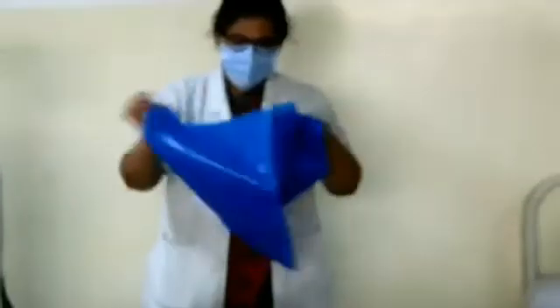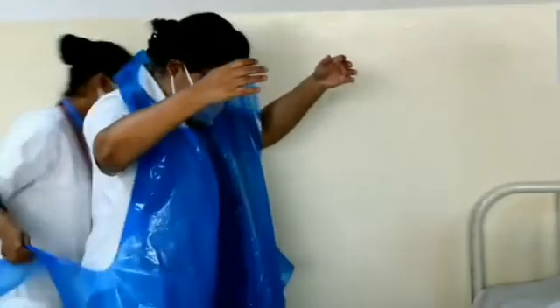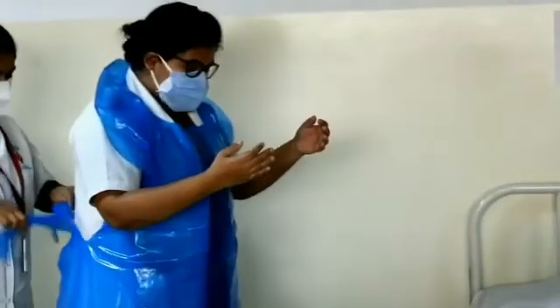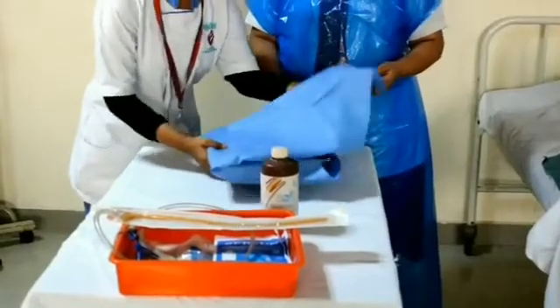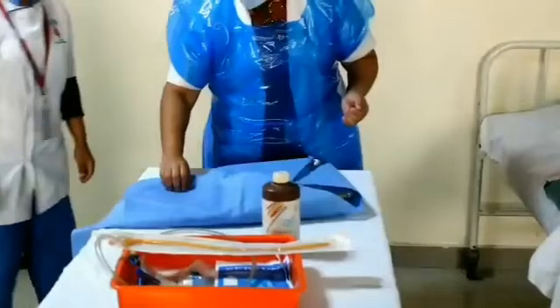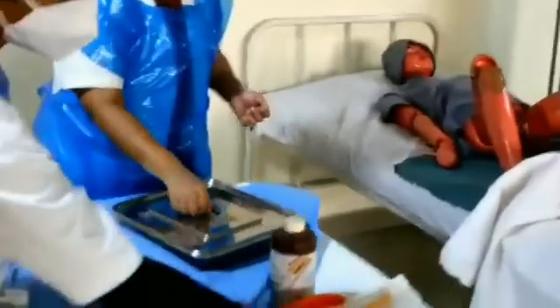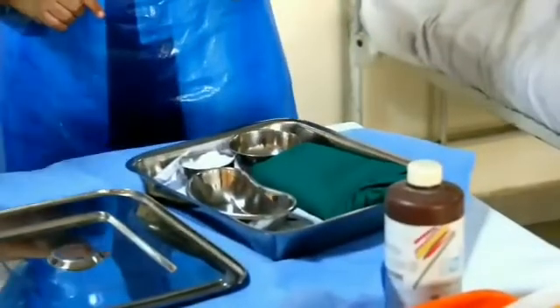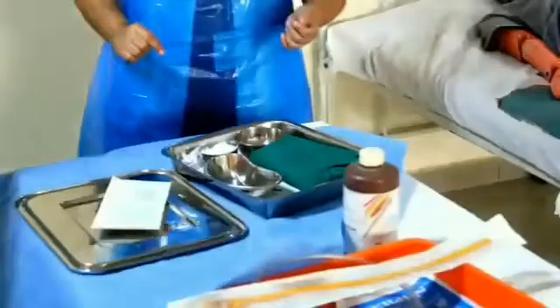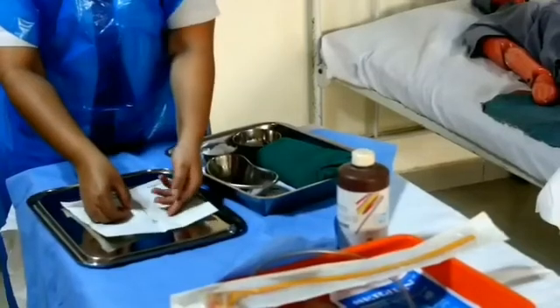After hand washing, put on the apron. The apron is tied by the assistant. Keep the hands away from the apron. Then open the sterile cover by maintaining proper aseptic technique. Wearing sterile gloves: the gloves are put on a sterile field. The pack is opened without touching the inside portion.